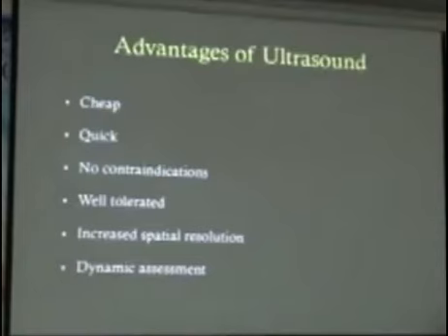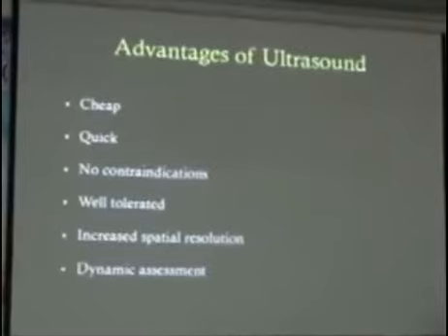So in Australia, we're actually finding that our ultrasound examinations of the knee are starting to become less frequent due to a lot of our patients having MRIs.